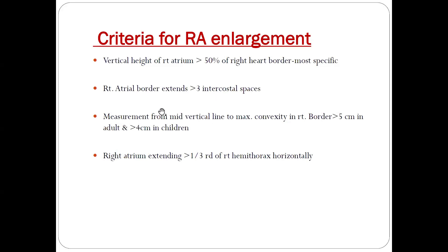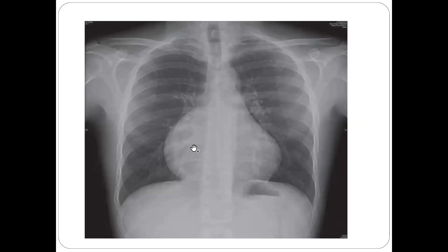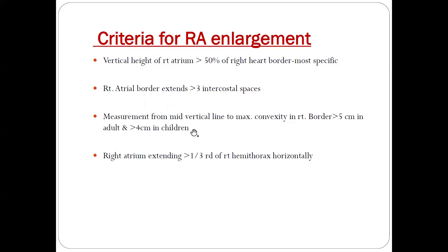Third criterion: measurement from the mid-vertical line to maximum convexity of the right border — more than five centimeters in adults, and more than four centimeters in children. From the spine, if this distance is more than five centimeters in adults and more than four centimeters in children, we can call it right atrial enlargement.